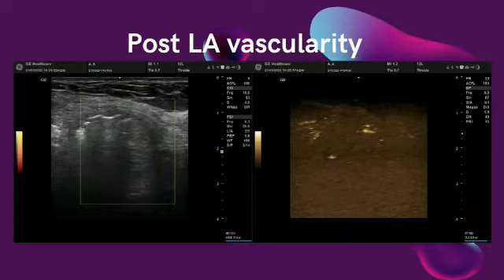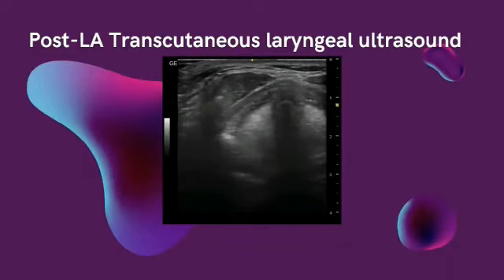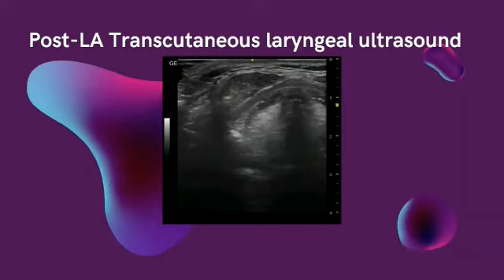The real volume of the area subjected to ablation can be determined 72 hours after the end of the treatment, as the cell damage becomes permanent. The motility of the vocal cords should be checked with transcutaneous laryngeal ultrasound at the end of the procedure.